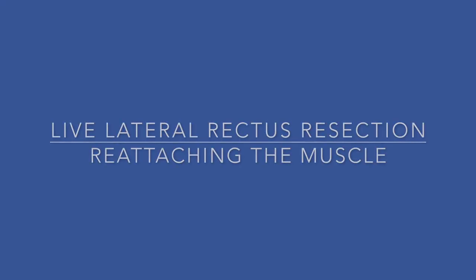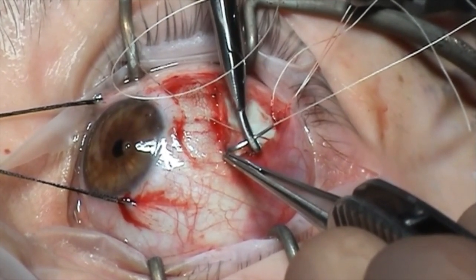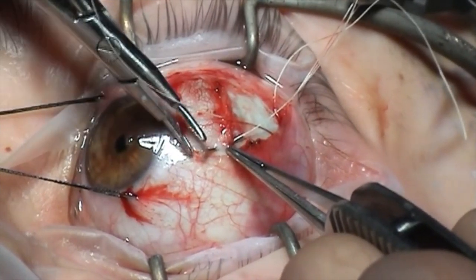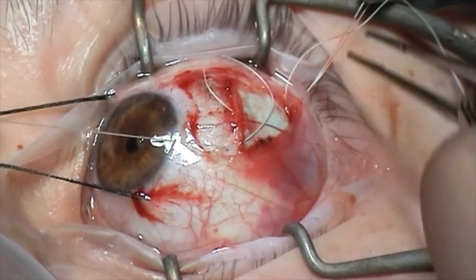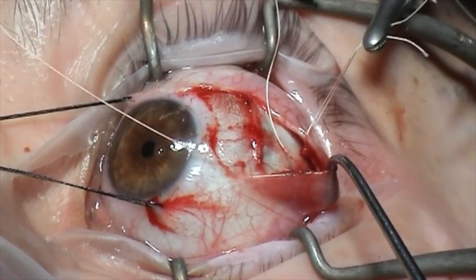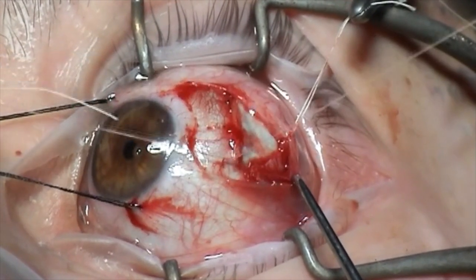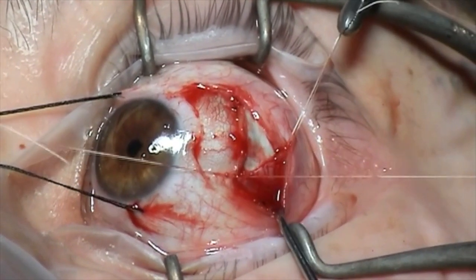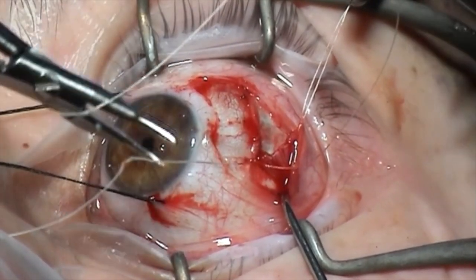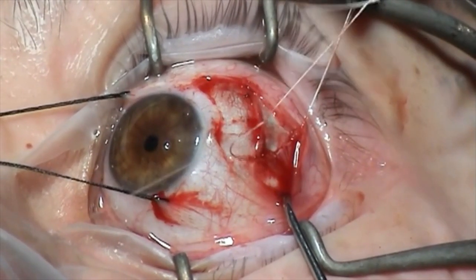Some live footage of the same lateral rectus being reattached. Holding the inferior pole of the muscle with St. Martin's forceps, passing the needle through the sclera — not through the remnants of the muscle, which would lead to an insecure reattachment. Our assistant holds the conjunctiva and Tenon's out of the way. A double throw on the needle holder, pulling the muscle up to the insertion and sliding the suture down to secure the muscle against the original insertion. A swift second throw and a third one to secure the muscle in its position and to prevent any slippage.